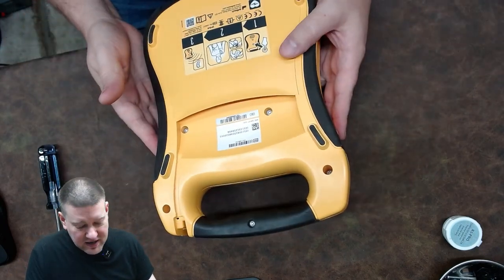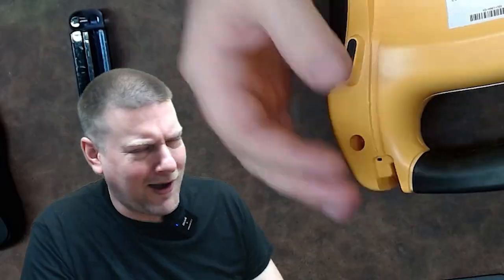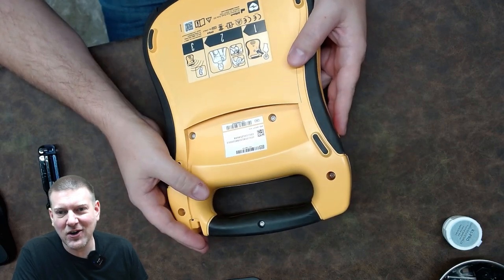Now, don't just go opening up defibrillators — they're very dangerous. I'm a trained professional. We're going to go ahead and do this right now, and if I get shocked, well, we're all going to learn something, right?